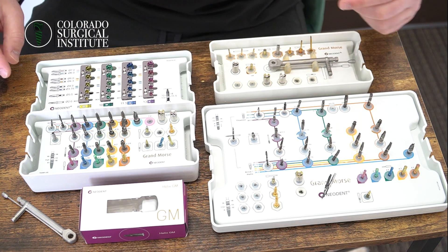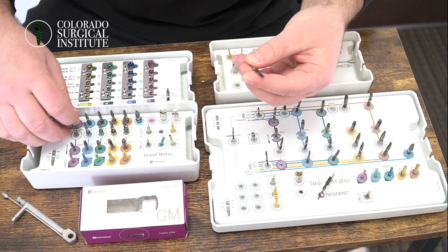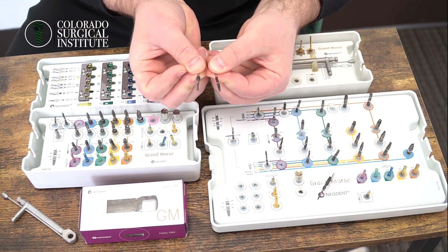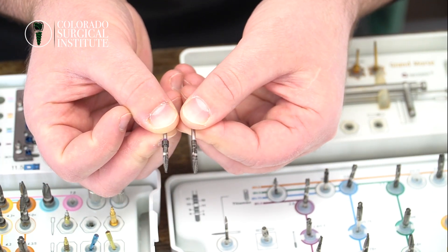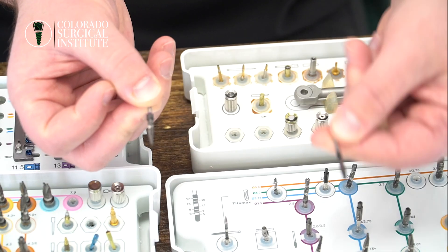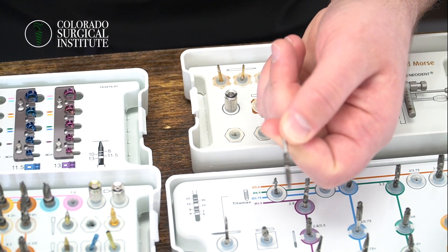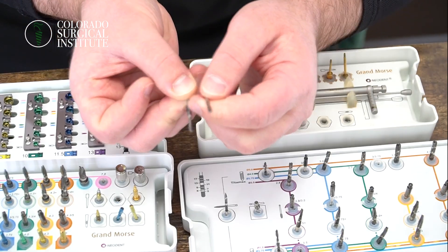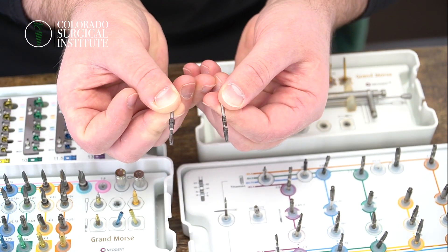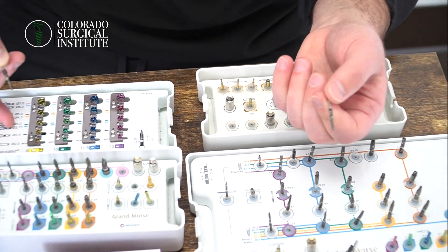Now the difference is if you're taking even like the 3.5s on both sides, you're going to see the difference. When comparing the 3.5 burr from the full surgical kit and the 3.5 burr from the Grand Morse compact kit, this one actually has a drill stop on it — a little ledge — which is really cool because it's going to work with this Neodent control stop drill kit.